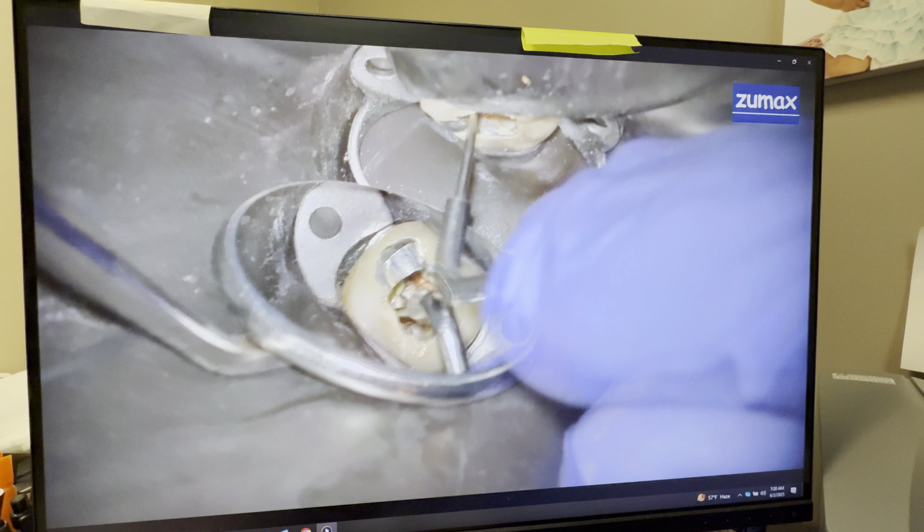We wait a few minutes, and then I'm going to place a different local anesthetic, this time Marcaine. Marcaine I like because it's long lasting, so it lasts throughout the treatment and then for a few hours afterwards. That way the patient has time to go home and start taking their pain medication before the local anesthetic wears off. Pain-free local anesthetic administered.